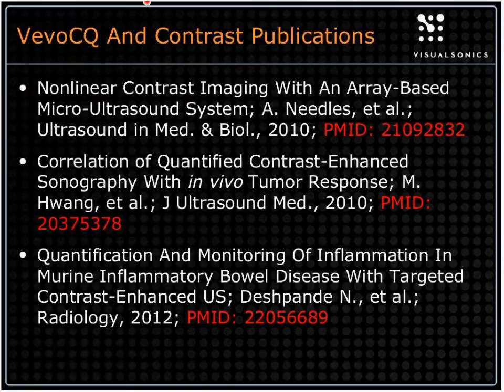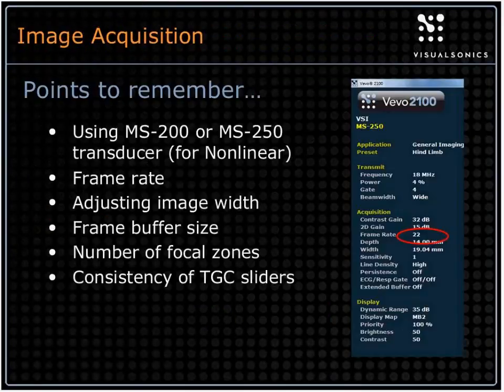So for anybody who has a system or is thinking about getting the system, I really recommend having a look at that on the customer portion of our website. It's a great resource to really see the types of work out there being done with the system.